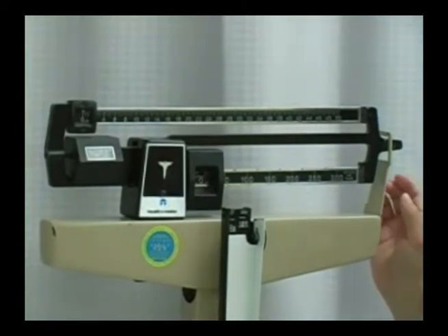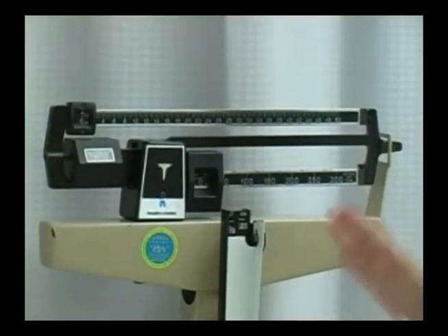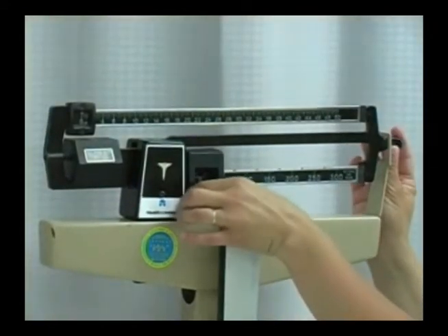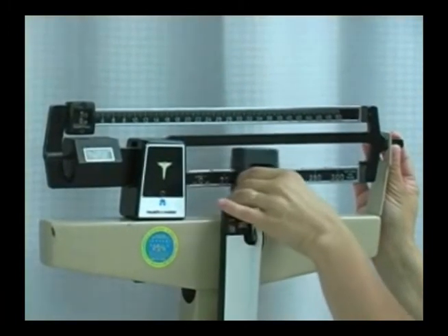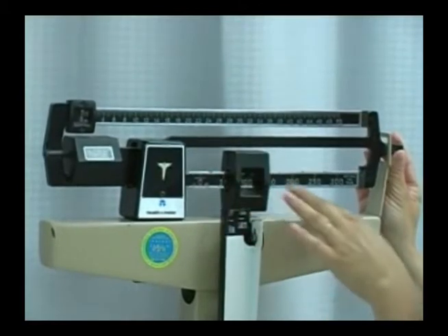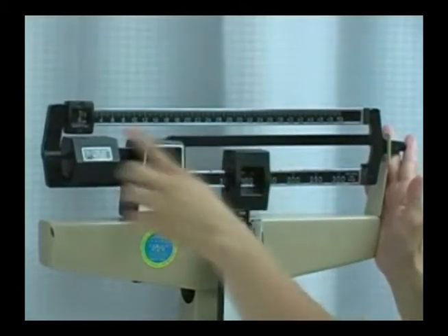After your patient has stepped on the scale, what you need to do is move this bottom weight over, and this is marked off in 50s. As you can see, it's 0, 50, 100, 150, and so you would have this go over to 100 here.